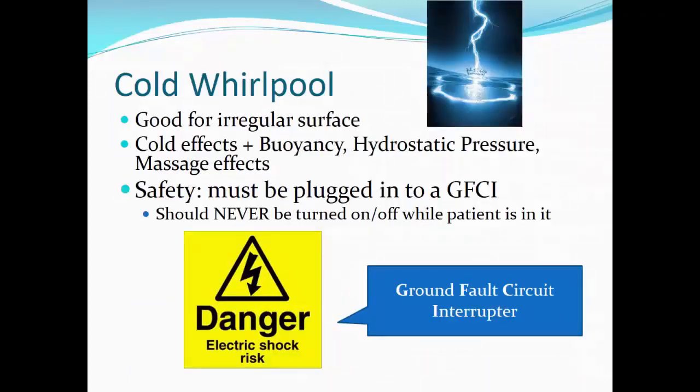Cold whirlpool treatments are great for irregularly shaped body surfaces, typically distal body segments. It combines the effects of cryotherapy with the effects of aquatic therapy, such as buoyancy, hydrostatic pressure, and the massaging effects of resistance. Safety is the most important thing. No patient should ever turn on a whirlpool while they are actually in the whirlpool.